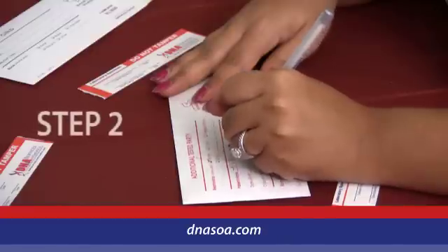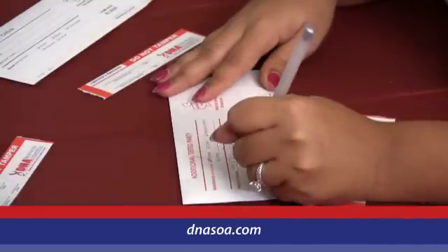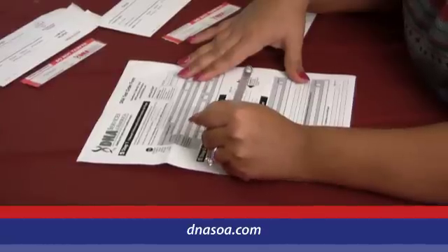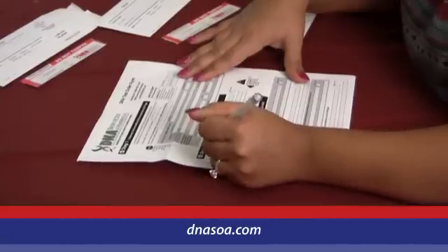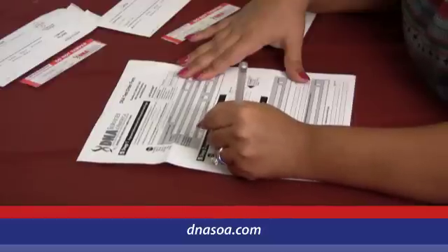Step 2: Fill out the front side of each buccal swab collection envelope. There is one envelope for each tested party. Step 3: Complete the order form and list each participant, so we can verify we received all samples and that none are missing.